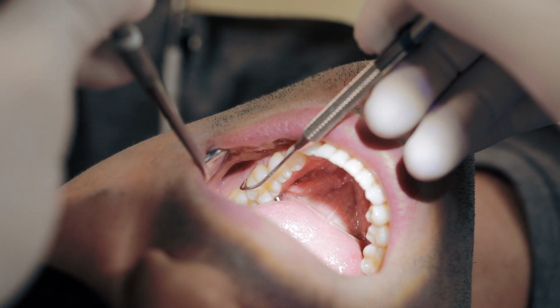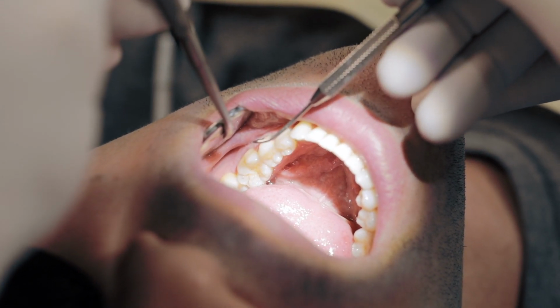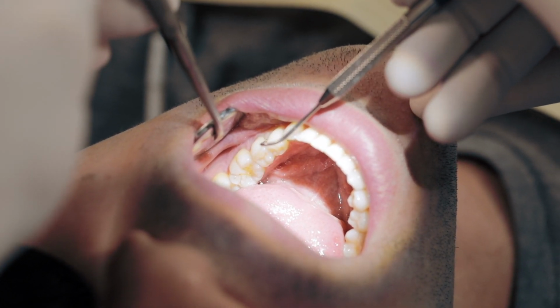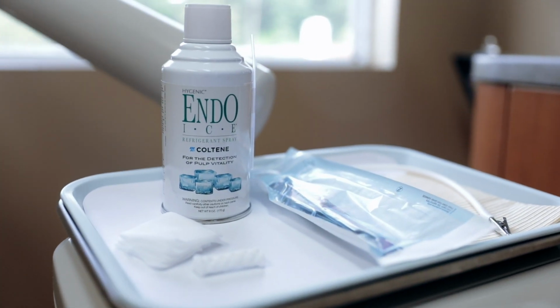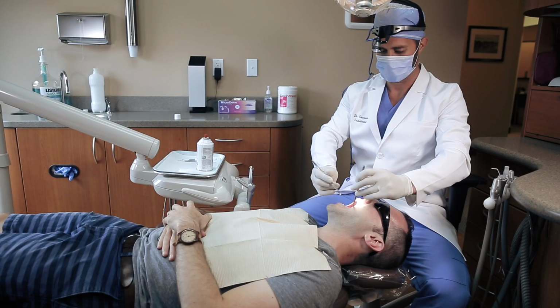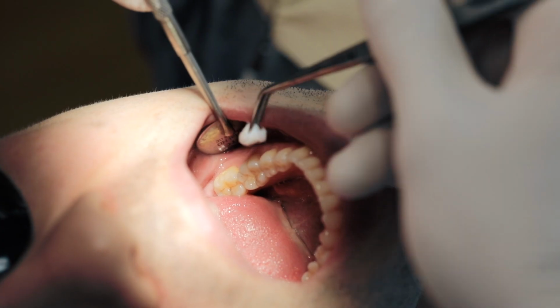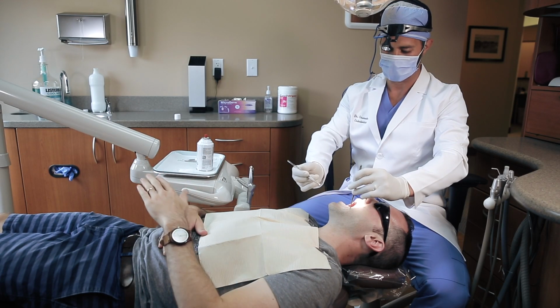Finally, let them know you're going to be now testing for nerve vitality. You're going to want to explicitly state this since you will be coding for this. So bust out your EndoIce to perform a cold test. Now this is very important. Tell your patient to raise their hand as soon as they feel the cold and leave it raised until it goes away. Once they don't feel it anymore, then they're to lower their hand.